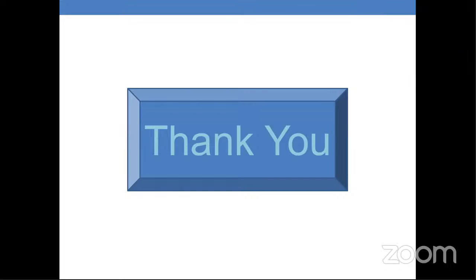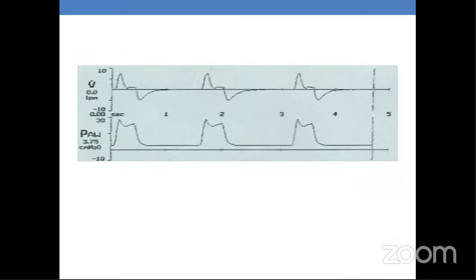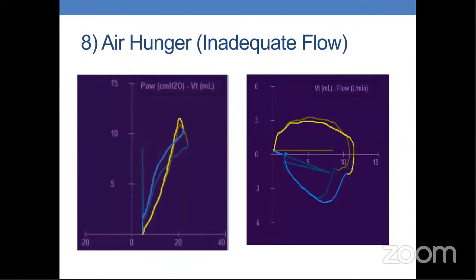Again, for the figure 8 in the loops, that means you are putting a pressure support and probably giving a very low rate. The solution is not only increasing the rate, because sometimes your rate might be right but you're not sedating your patient, or your patient does not even need intubation. If he's on pressure support, either sedate the baby or extubate. I agree totally.